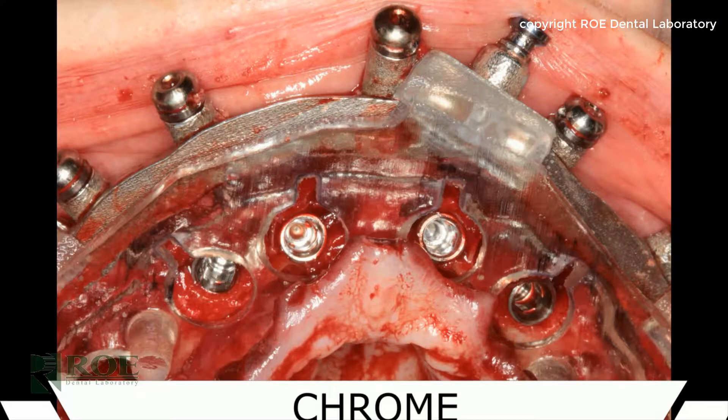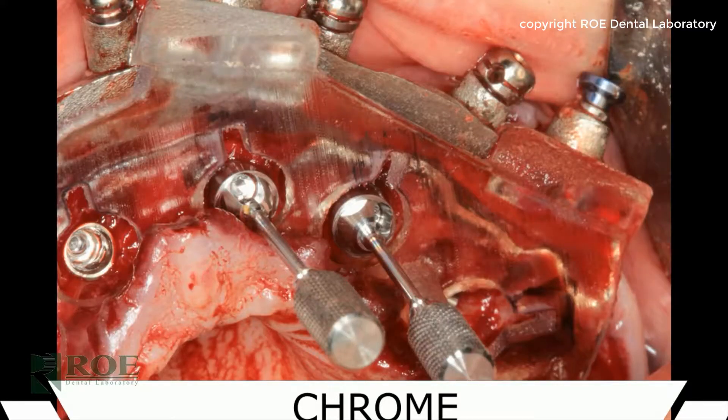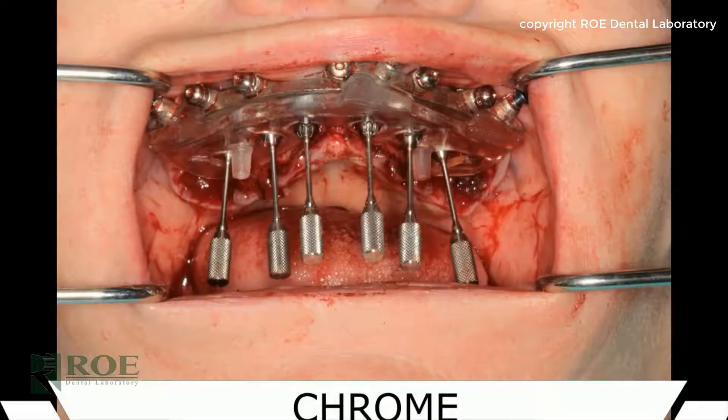This doctor uses a bone profiler to open up some of the bone around the implants, especially on the angled ones. Once the bone is removed, the multi-unit abutments are seated — they should all be parallel as planned. Then the temp cylinders are installed. As you can see, this case was carefully planned and diligently followed with the guided protocol system.